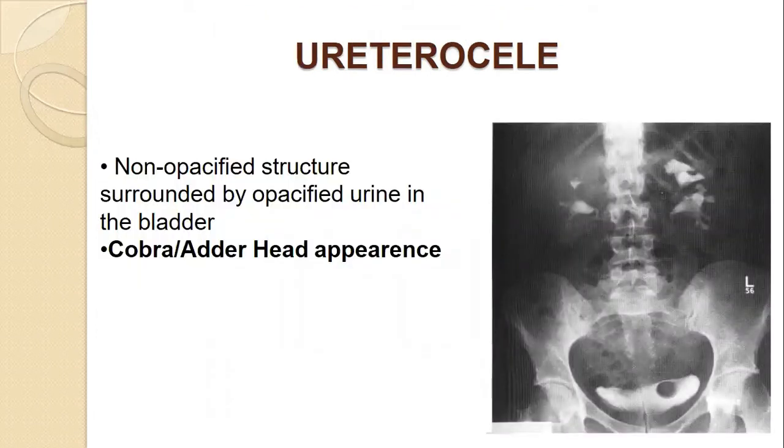Any senior resident can tell about this. Dr. Najib, can you comment on this? What are the findings? Don't go for diagnosis. Sir, I can appreciate a dilated pelvic system on the left side.